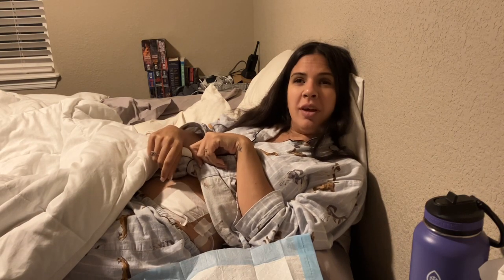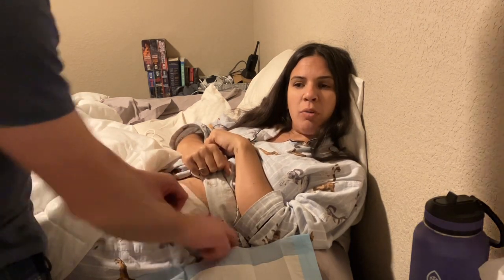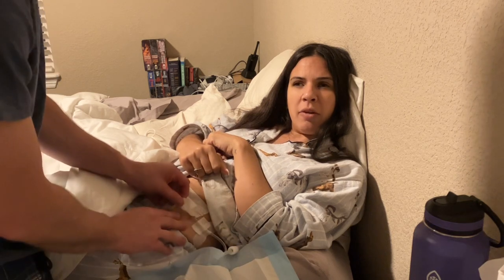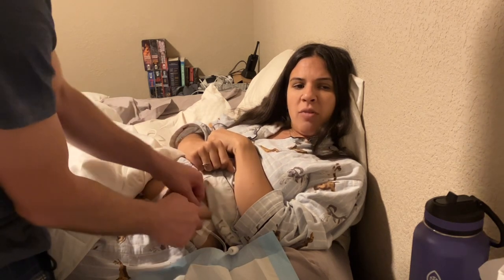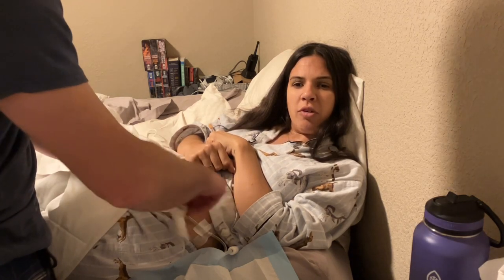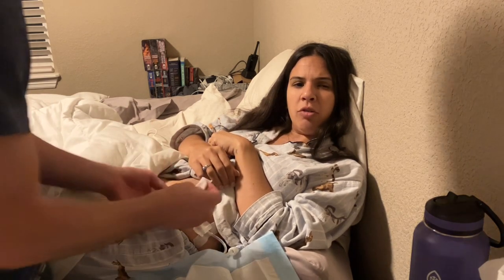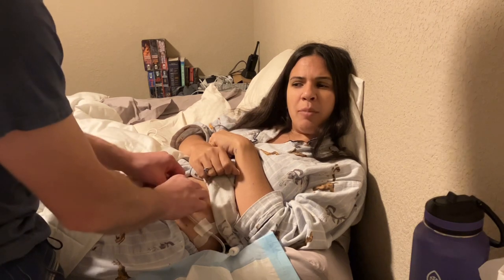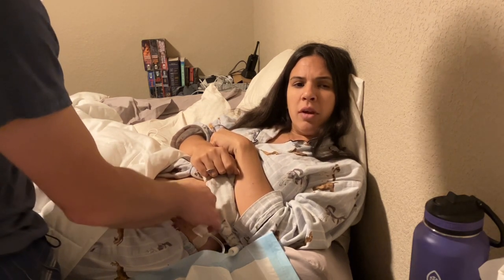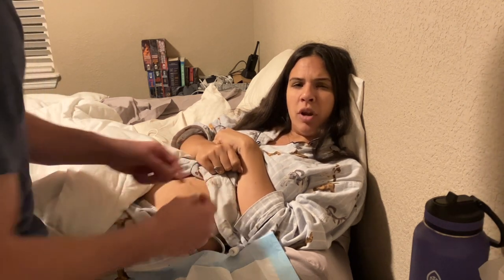Now he is going to take off my dressing. I wear this dressing on my wound every day. We already untaped my catheter from the side of my body. I have tape marks all over my body because I have tape every day. So he's taking off the dressing. We change my dressing every single night because this wound can get infected — it's an open wound. Now he's going to clean it with what's called Exsept, which is like a bleach skin cleaner — not like actual bleach, but it has a safe bleach in it. He's using a gauze and just cleaning around the wound and underneath the catheter.